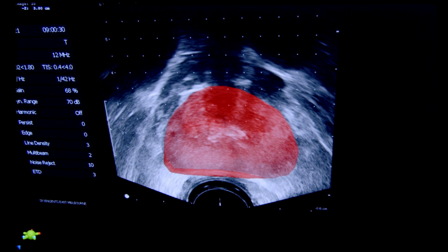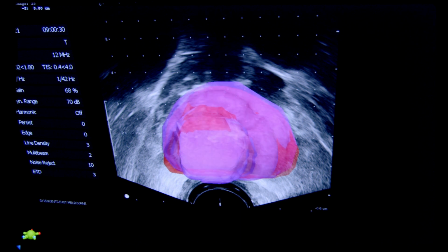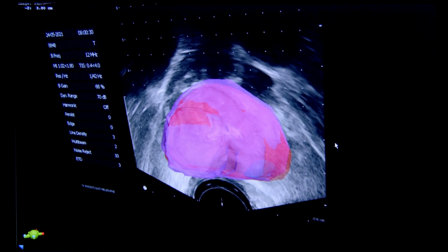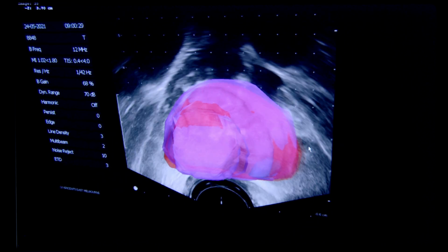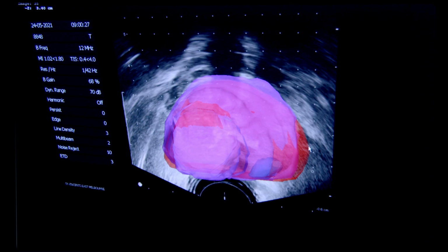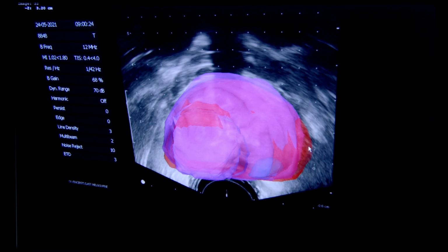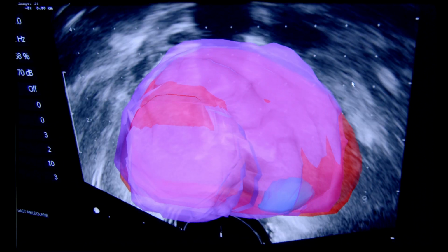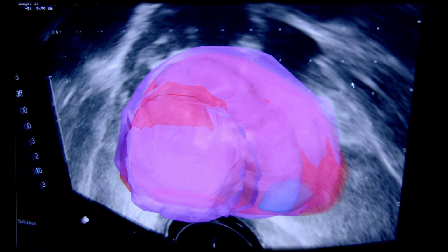Before we start the biopsy, both the ultrasound and the MRI images were fused using a software fusion. The software fusion allows the previously acquired MRI to be aligned to the captured ultrasound image. The fused images provide an accurate 3D location of the suspicious area of concern and allow real-time tracking of the procedure. This allowed the biopsy procedure to be done in real time with greater confidence and accuracy.